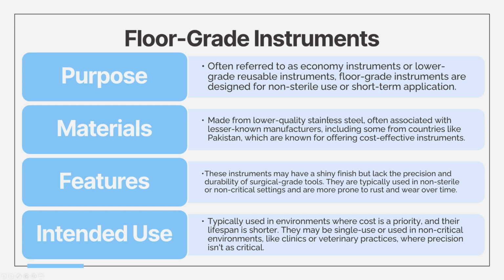If you are actually working in the MDRD, especially in the assembly area, we have assignments catered to build only trays for the OR room, which are used for elective cases, emergency cases, urgent cases. All of these are scheduled in advance, like months in advance, or obviously for emergency cases, they are done as soon as possible.